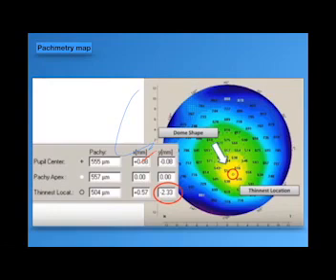If more than -1, don't do any refractive surgery, because it's one of the signs of corneal shifting and corneal protrusion. The deviation is vertical and inferior. But if the deviation is vertical and superior, you can neglect this deviation because of the causes we talked about in the slide of the topography.